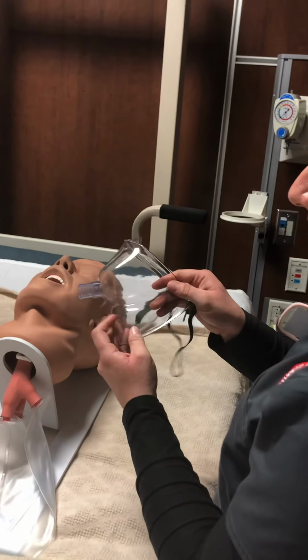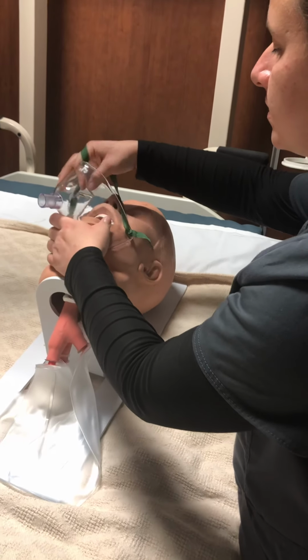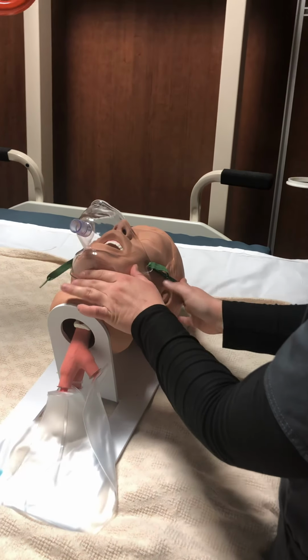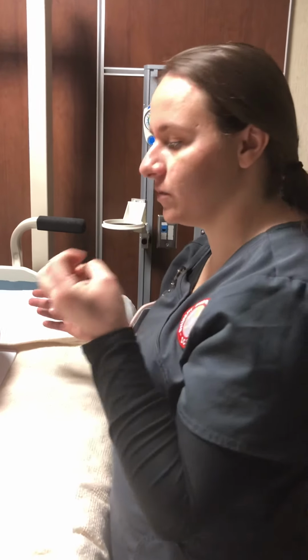So here I would place this at the bottom because that's where the chin would go. So I place it down here, make sure it's kind of spread out so that way it's not harming the patient there. I place that around, and this way it helps. It still gives them the oxygen that they need, but then it's not going to touch the nose and it's not going to make them feel claustrophobic, especially that's where they had the surgery.